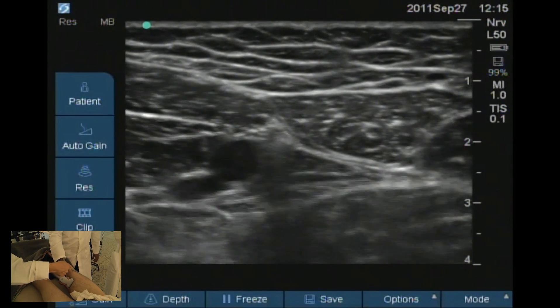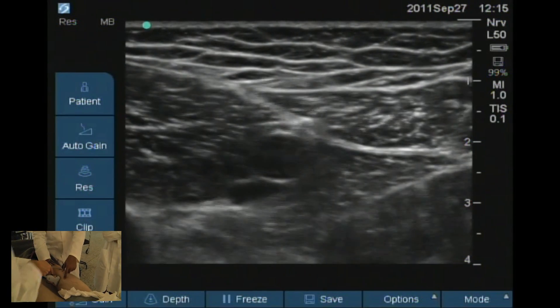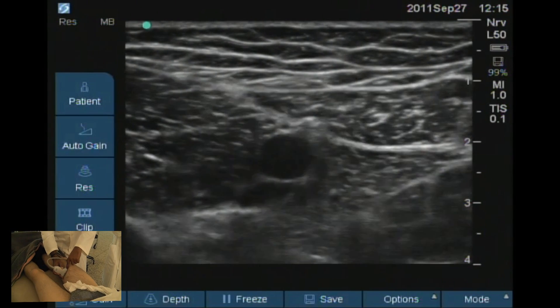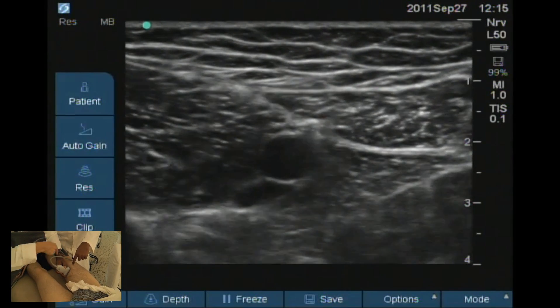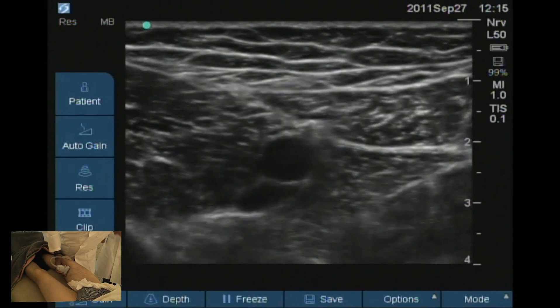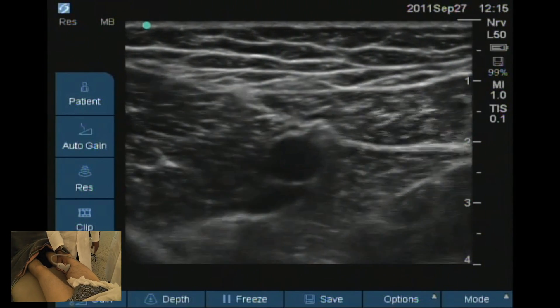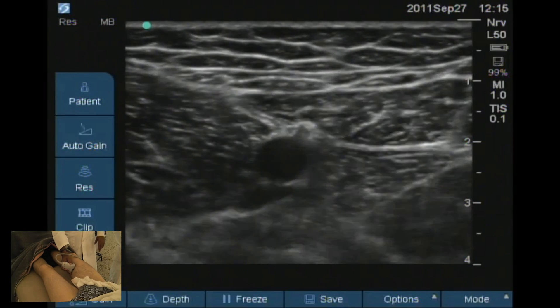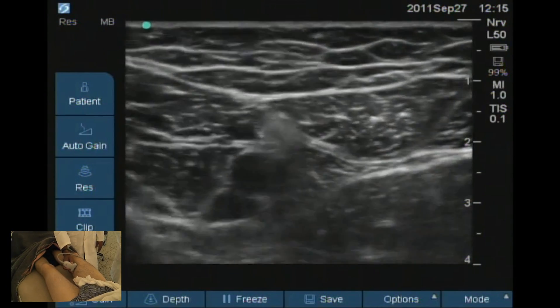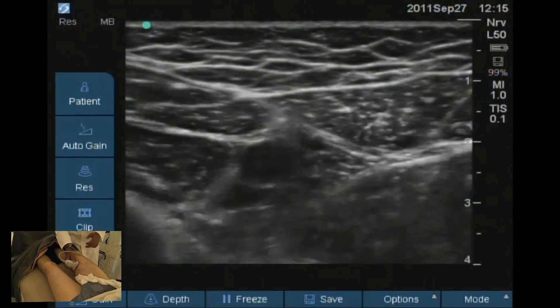How do you inject for this block? In-plane, lateral to medial — you see my finger pushing there. Your needle will be coming from lateral, just above the artery, and about five milliliters will be enough. It's a very good and easy approach from the patient's standpoint — you don't need to move the patient. That's what we do when we perform blocks for ankle surgery.